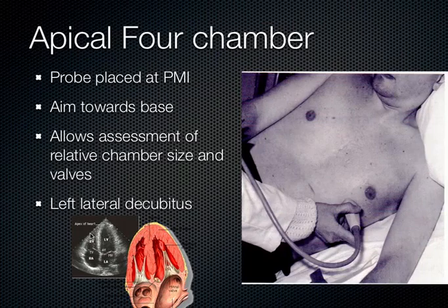As the right ventricle gets bigger and bigger, there could be some problems with the right ventricle trying to pump blood against an obstruction like a pulmonary embolism. In the setting of massive pulmonary embolism, or blood clot in the lung, the right ventricle gets so big it approximates the size of the left ventricle. So that's how I use this view clinically.